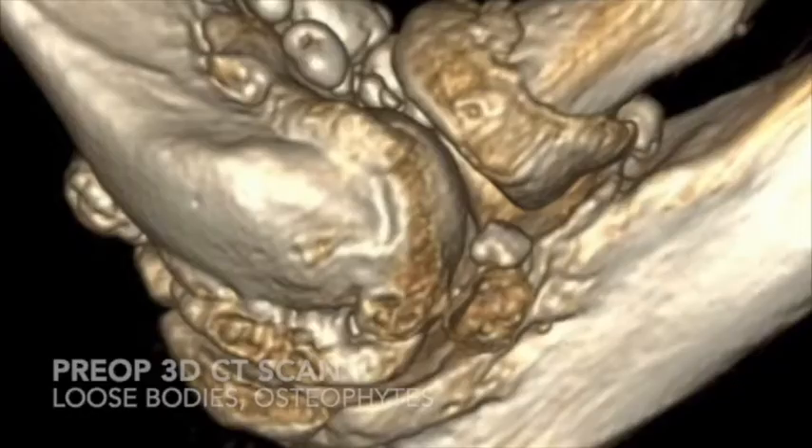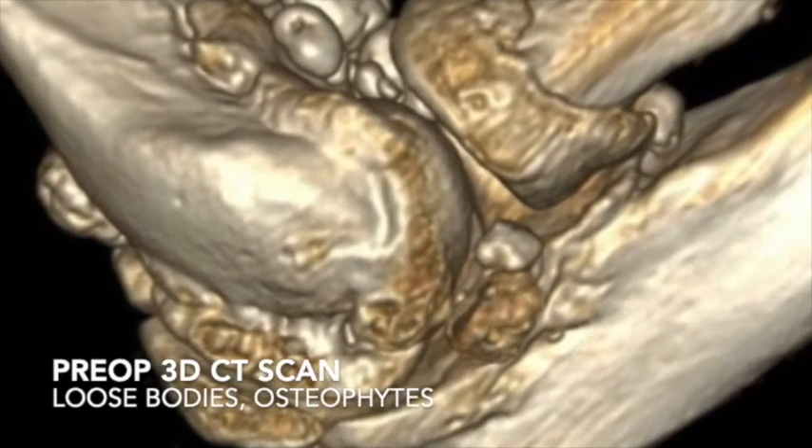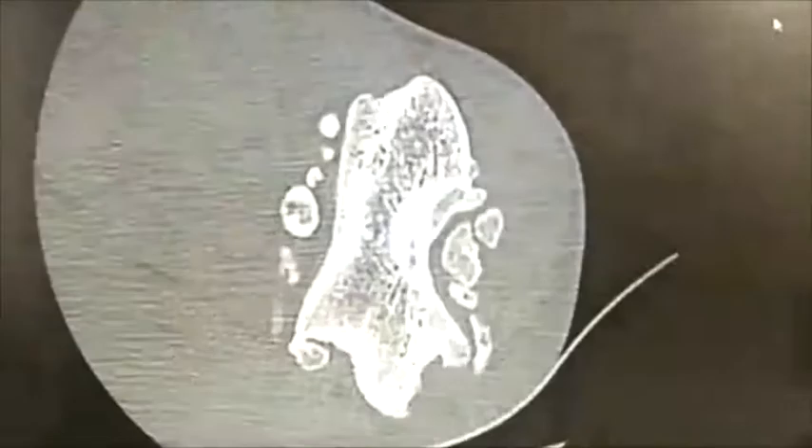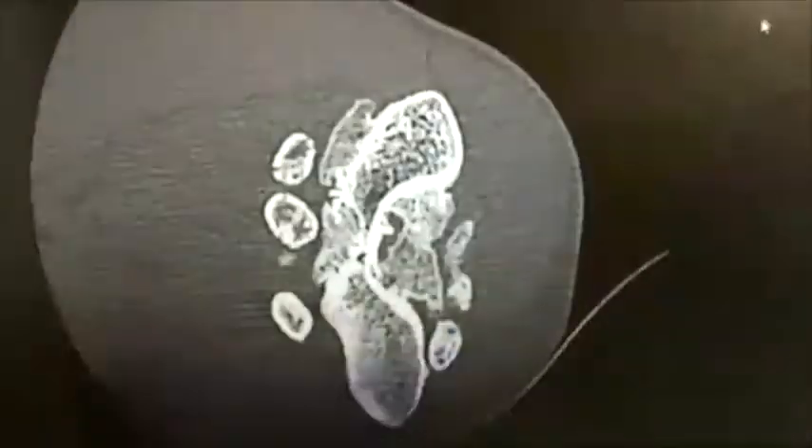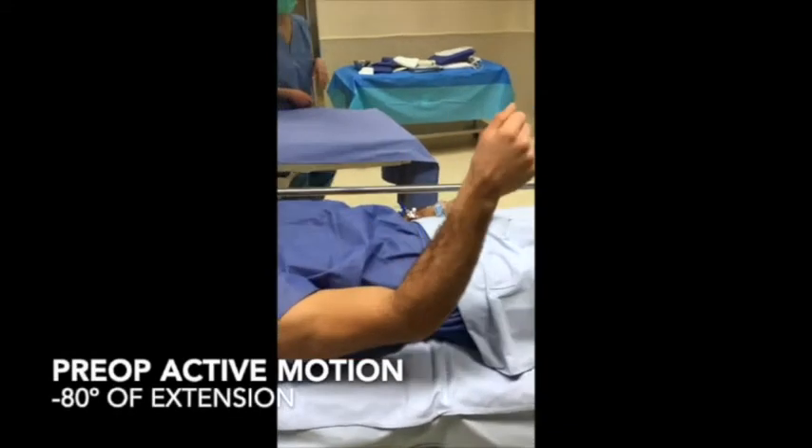This is the case of a 28-year-old man, a professional judoka, with a very significant loss of motion of his right elbow due to degenerative osteoarthritis caused by his sports activity over many years.